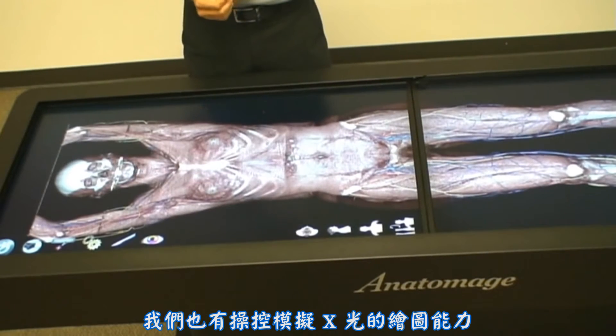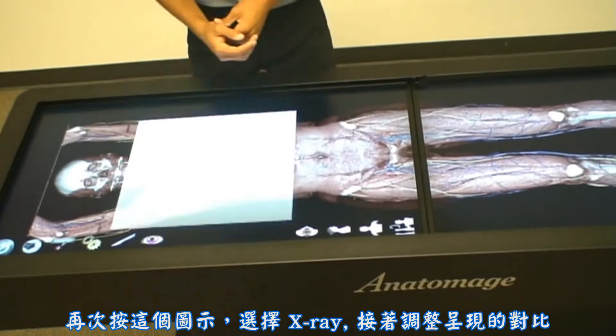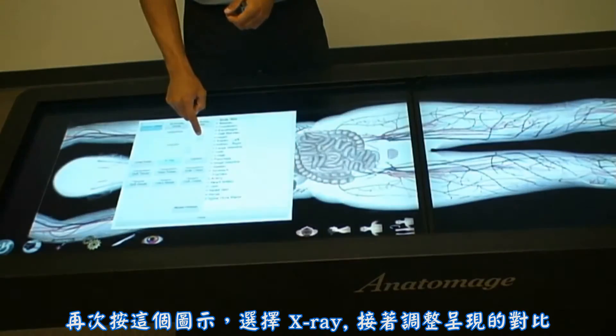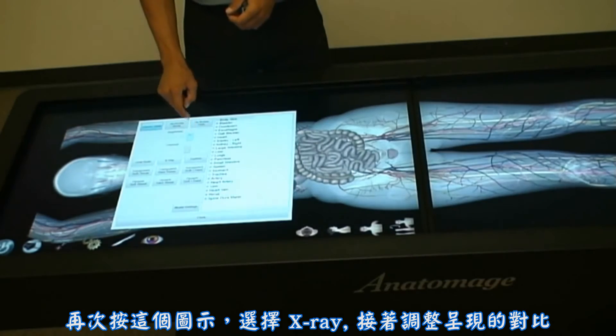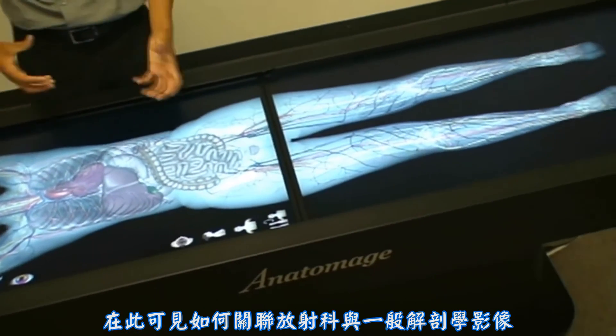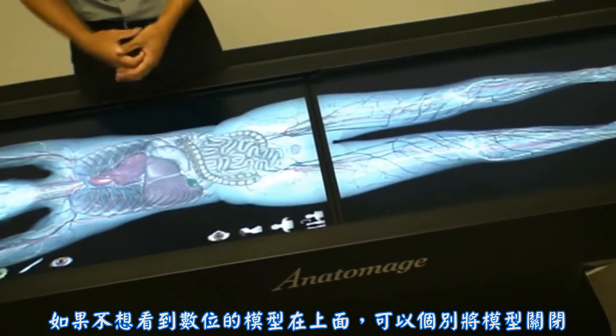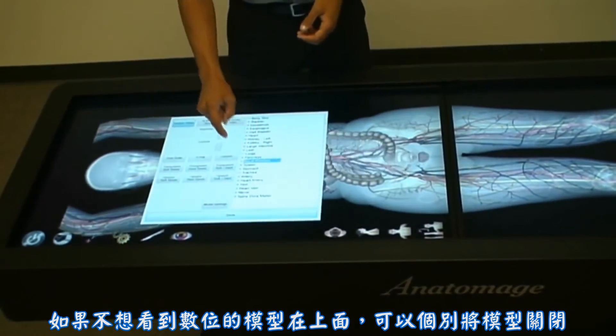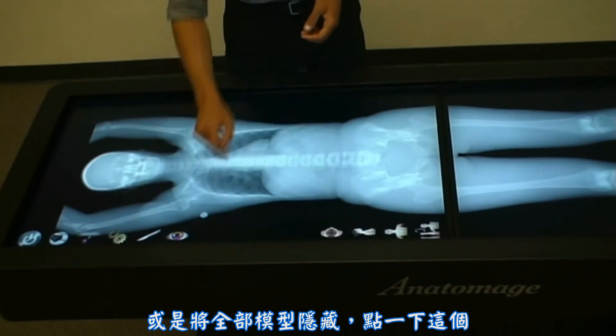We also have the ability to mimic X-ray renderings. Clicking on this icon, choosing X-ray, and adjusting the brightness and contrast, we begin to see how we're relating radiology with general anatomy. If I don't want to see the digital models on top, I can turn them on or off independently, or hide them all with a single click.